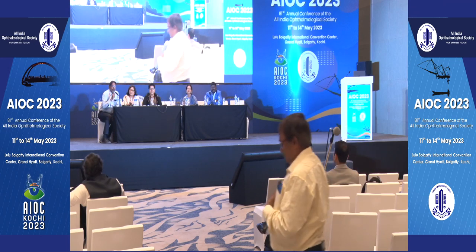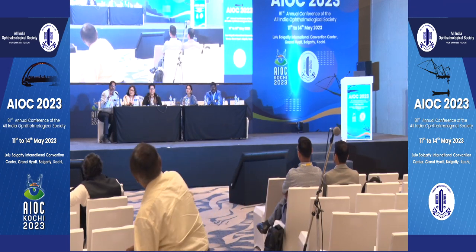Sir, we are talking about inert foreign bodies like glass, diamond, gold. In those cases, you can safely leave them. Even then, you'll have to do six-monthly follow-up with vision and ERG to check toxicity. But iron, because it's magnetic, we have got a lot of good magnets. You can safely remove iron foreign bodies much more easily. And if you leave iron inside, the risk of siderosis is considerably high. So iron foreign bodies, do not leave inside the vitreous cavity.